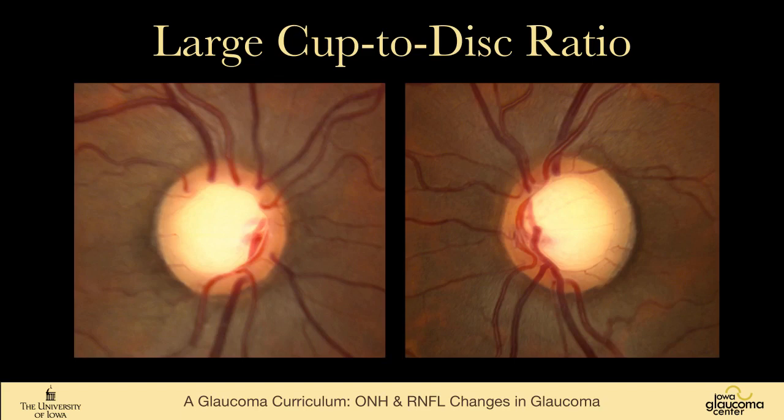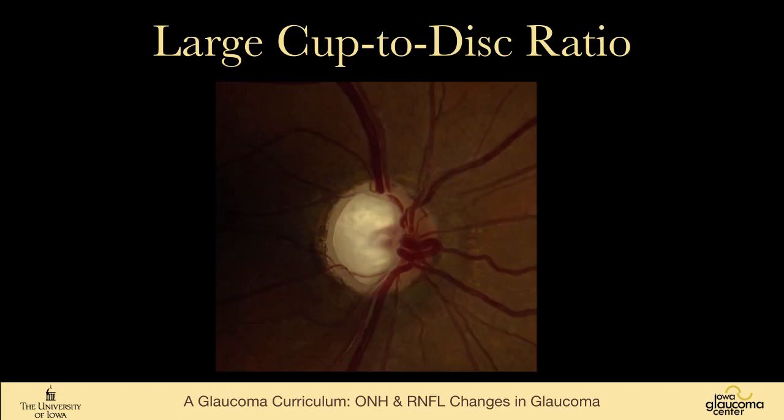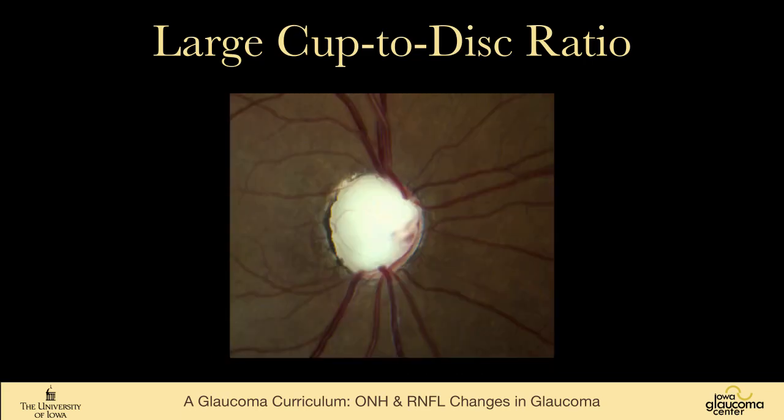So these are large cups in a patient without glaucoma, pink rim all the way around. This is a large cup in a patient with glaucoma, very deep cup. You can see that the vessels dive in to this cup at the border. And this is a totally cupped optic nerve in a patient with advanced glaucoma.